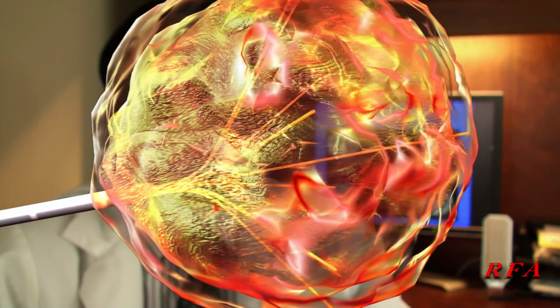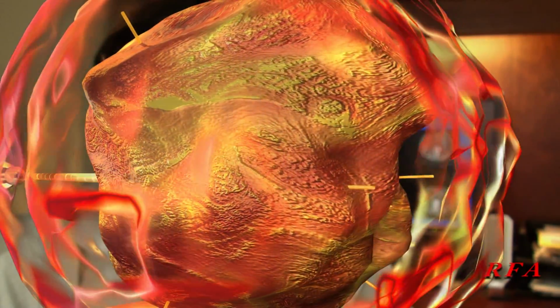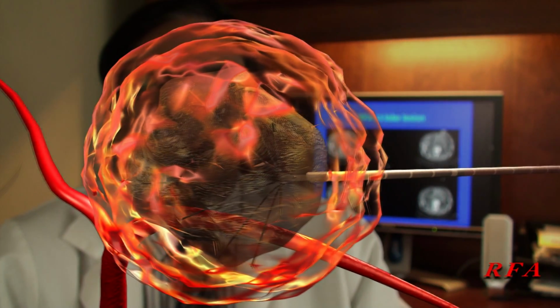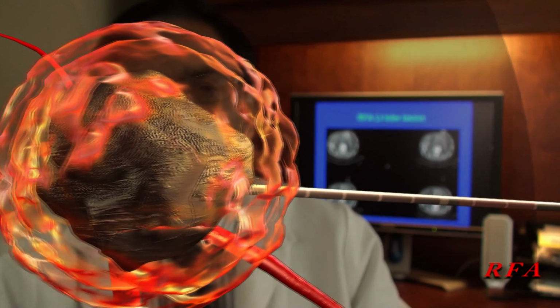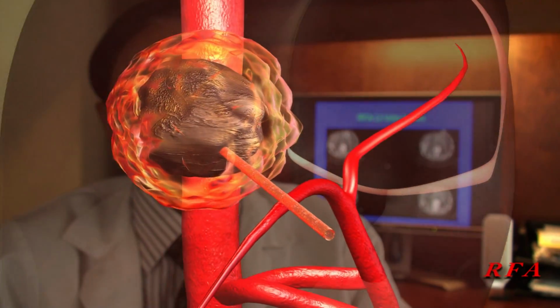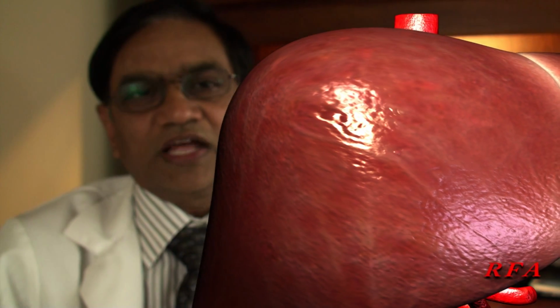Then we apply the radiofrequency current. This current will generate heat up to 105 degrees centigrade, and that is when the tumor starts getting destroyed because of the heat. And this radiofrequency is applied for approximately 6 to 12 minutes depending on the size of the tumor. And once the tumor is completely ablated, we withdraw the probe after closing those prongs, and we ablate the track as we are coming down. And the whole procedure takes anywhere from half an hour to 1 hour. And that's how we try to ablate tumors of the liver by radiofrequency ablation.